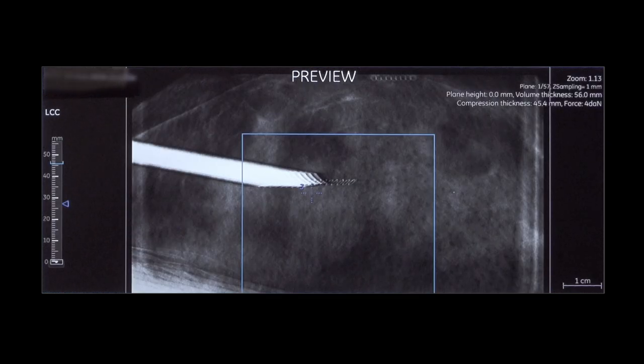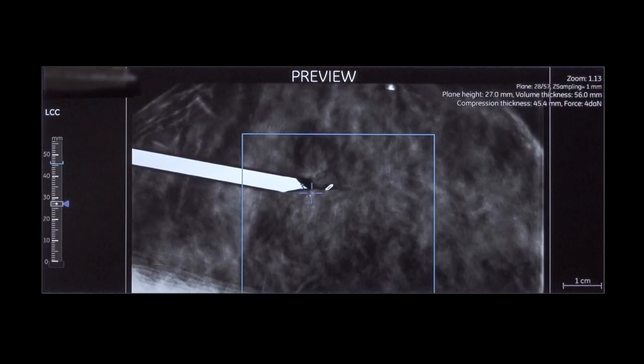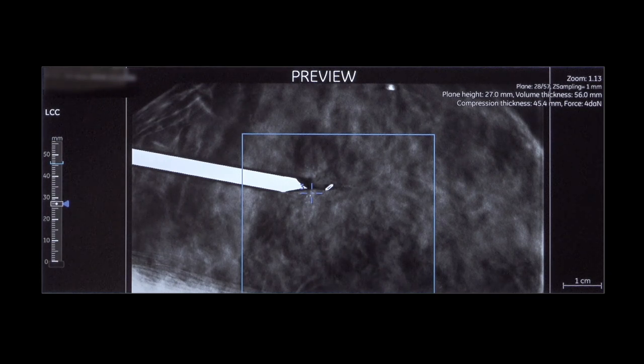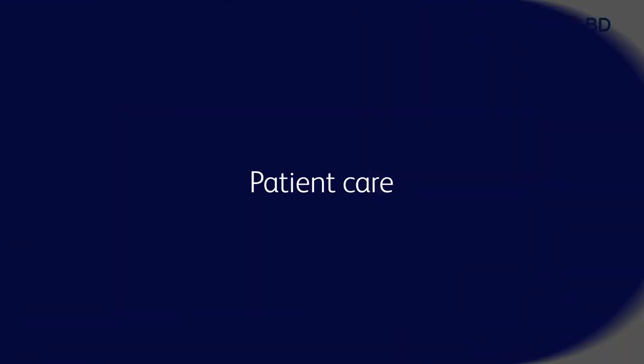Scroll through the planes to check the tissue marker placement versus the biopsy coordinates. To minimize migration, both the probe and tissue marker applicator are removed from the breast as a single unit.